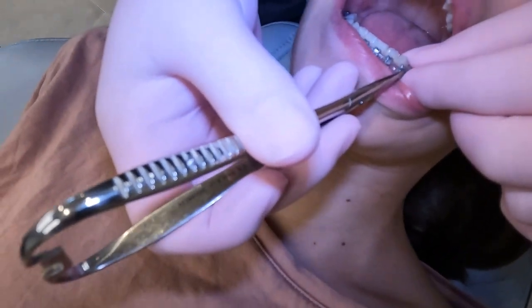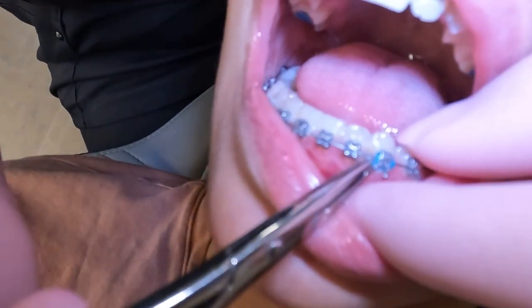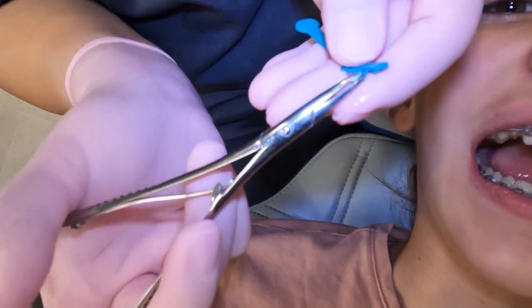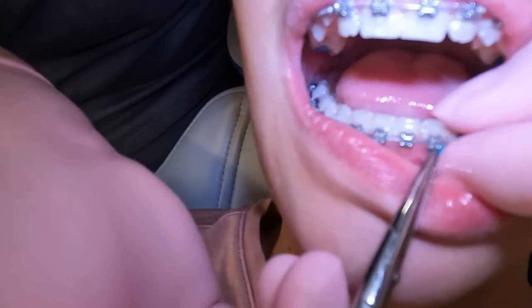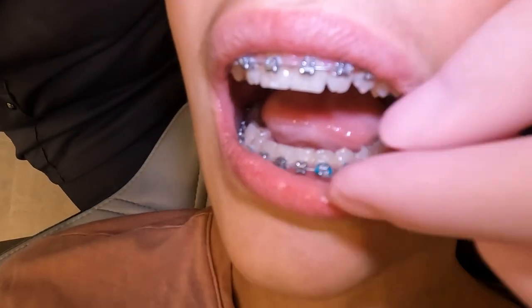Once you're all done at your orthodontic visit, you have the opportunity to put colors back on or a power chain depending on what your needs are. Now we've done our orthodontic adjustment and we are ready to put the colors back in. Remember, hygiene is important — those little extra ties and the power chain can make it harder to clean around. So we have our instrument right here, the hema staff. You grab the color and slowly move around that. You hear that little click, click, click, and you pull the lip away, around, around, down. Very nice.